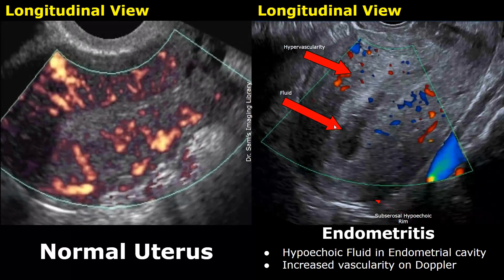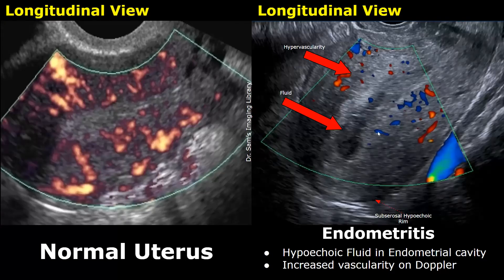In this image on the left, power Doppler is applied to detect slow blood flow in the uterus. In the image on the right, color Doppler is applied. The endometrial cavity is filled with hypoechoic fluid and a subserosal hypoechoic rim is also present. When these two features are present, you may find increased vascularity in and around the endometrium due to inflammation.